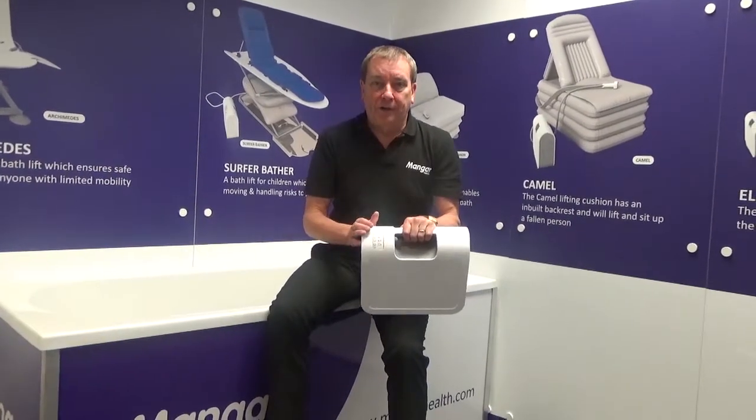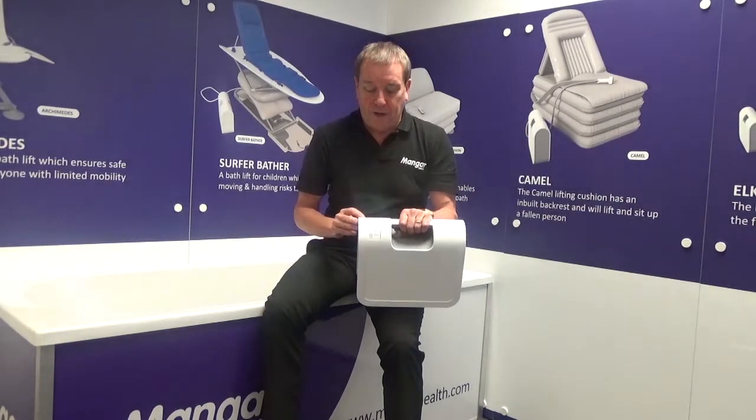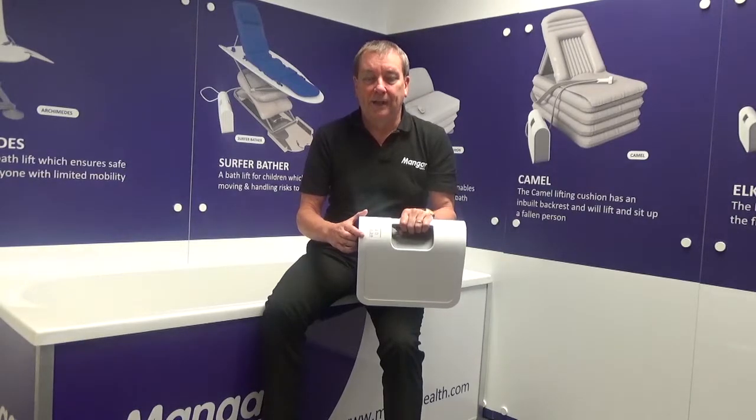The cycle to charge the battery is as follows. Once we are plugged into the mains and the charger is connected to the Airflow, the bottom red and one green light will come on. This will be the case for the first two hours of charging. As the charging session progresses more lights come on until after 16 hours all four lights will be showing green.